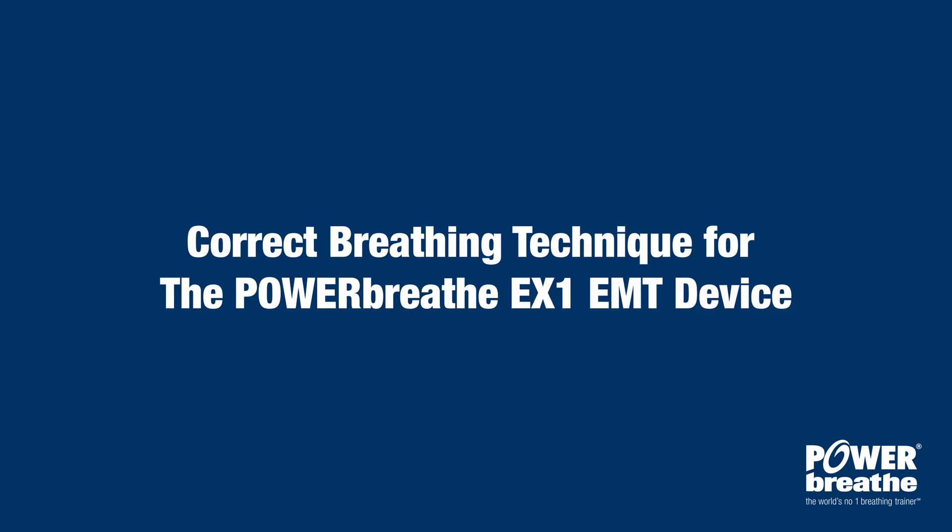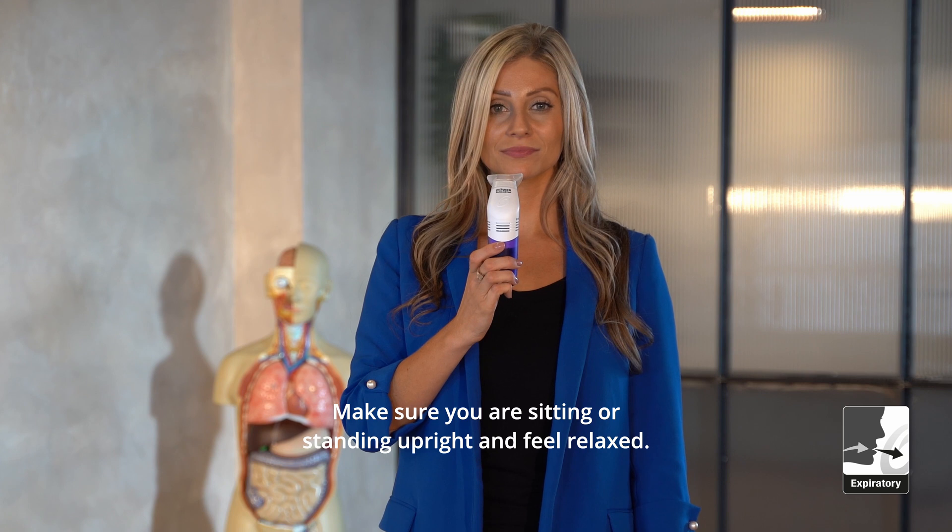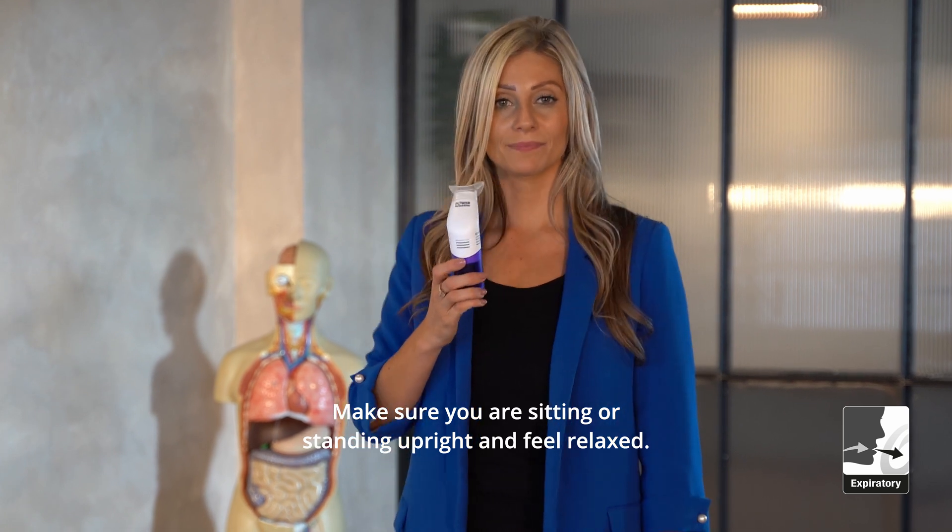Correct breathing technique for the PowerBreathe EX1 EMT device. Body position: make sure you are sitting or standing upright and feel relaxed.